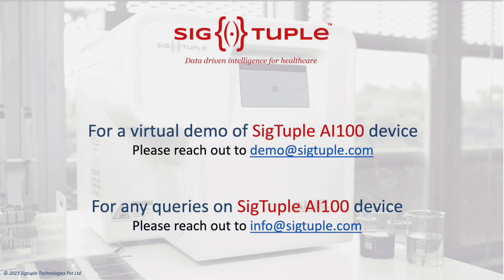I think we have another question there, Richa, about the time. There's another question by Akash. How long does it take from scanning to reviewing the slides? It takes 3 minutes to scan this slide in the device. And as soon as it's scanned, it can be uploaded on your tab, and you can see it immediately. So within 3 minutes.